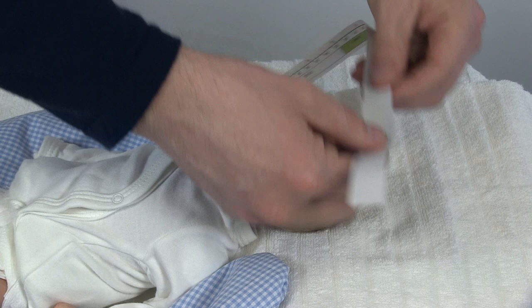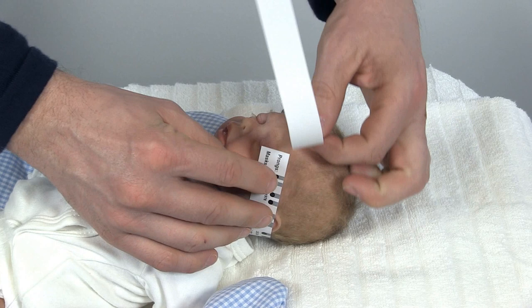Firstly, use the measurement tape to determine the right bonnet size. In this case, you need the light blue bonnet.